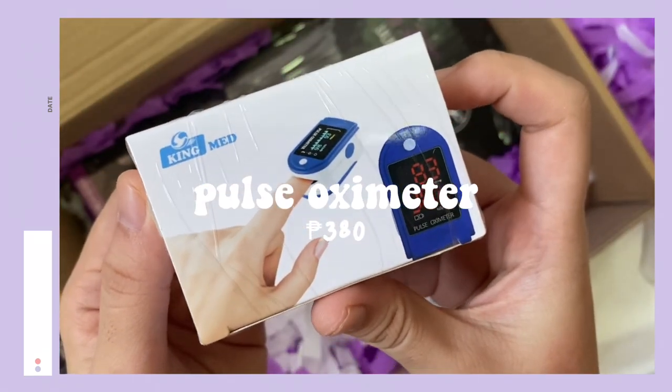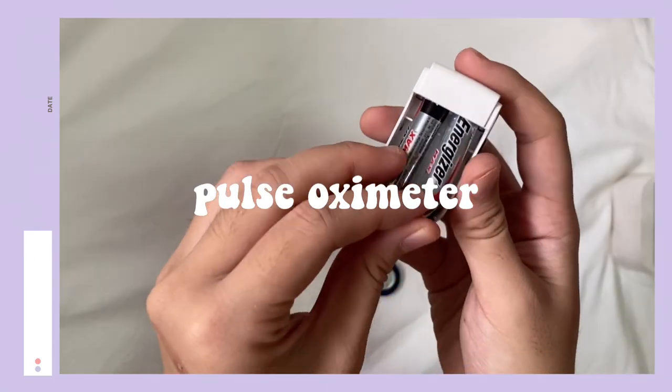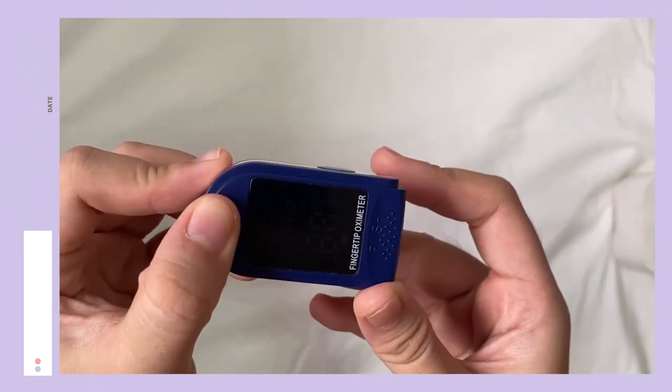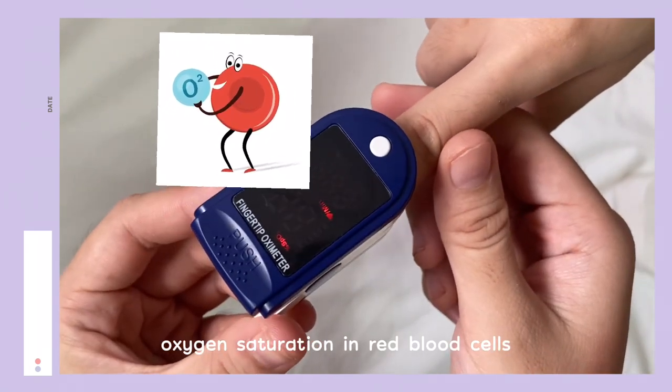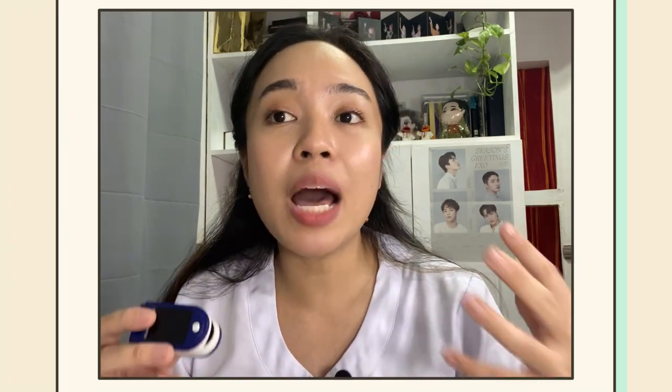Next is the pulse oximeter. The pulse oximeter or pulse ox is an electronic device that measures the saturation of oxygen carried in your red blood cells. In Tagalog, ibig sabihin po, tinitingnan nito ang level ng oxygen sa dugo ng isang tao. So gamit itong level na ito, malalaman natin kung sapat bang oxygen na nasa dugo natin.